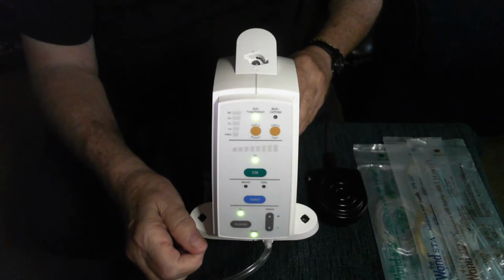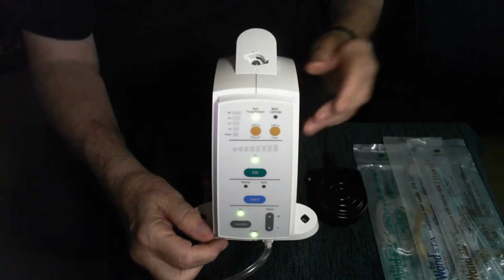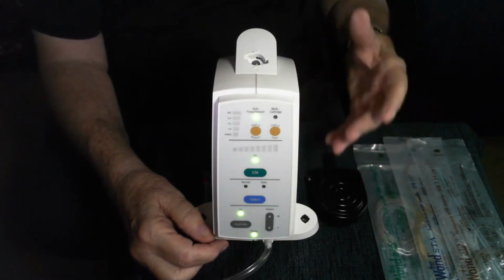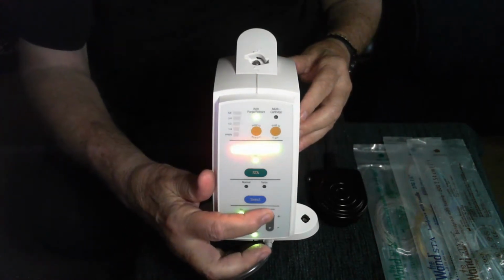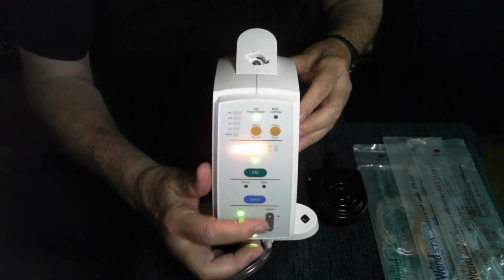I would suggest leaving it on all the time, not just to determine if the needle is in a blood vessel or not before you inject anesthetic, but also whenever you want to take the needle out of the tissue, you can go into aspiration where everything is going backwards into the system. And in the middle of aspiration, you can take the needle out of the tissue without getting any anesthetic into the patient's mouth. These allow us to adjust the sound. It can be very loud, or you can make it very, very soft, depending on your preferences.